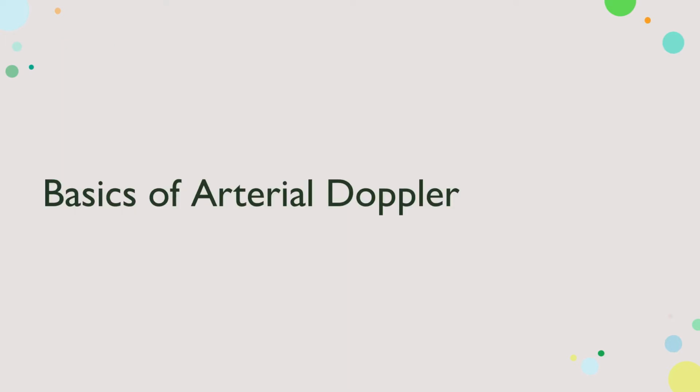We're going to start with basics of arterial Doppler, and I'm going to talk fast through this because you are going to be able to watch this on video, and so if there's anything that you have questions about or need more time to listen to, you can just pause it and rewind it. So I'm going to go through these pretty quickly.